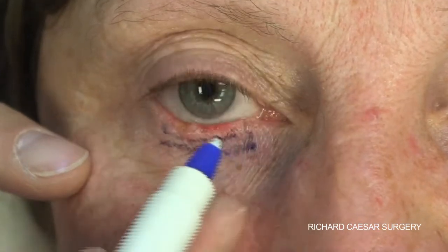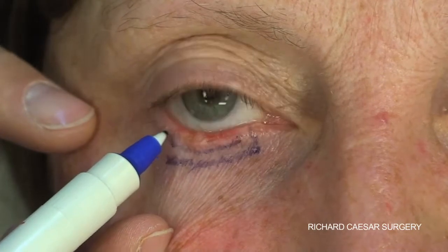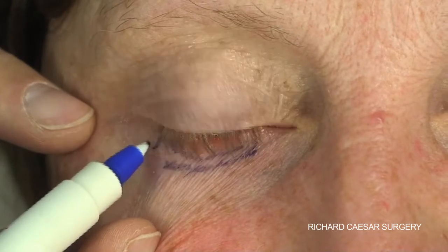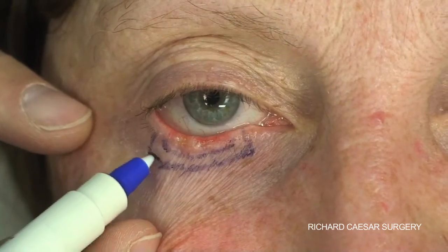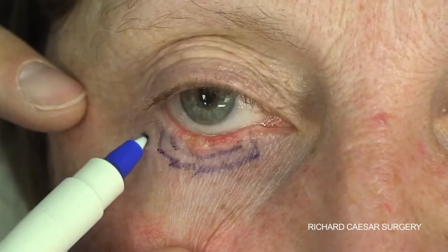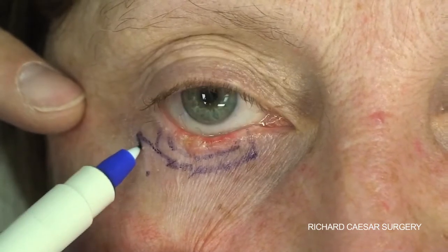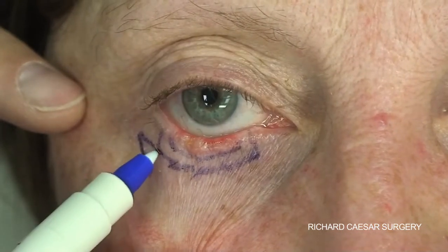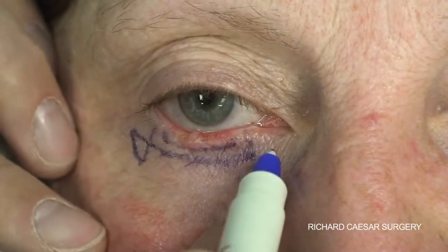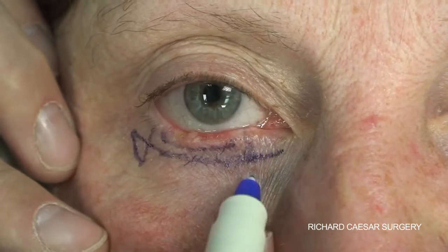The first step is to mark the edges of the basal cell carcinoma and then mark a 4mm margin around this to ensure a full excision. The next step is to extend two Burow's triangles to the same vertical degree as the excision. These two triangles will then make it very obvious how the skin is going to advance onto the Hughes flap.